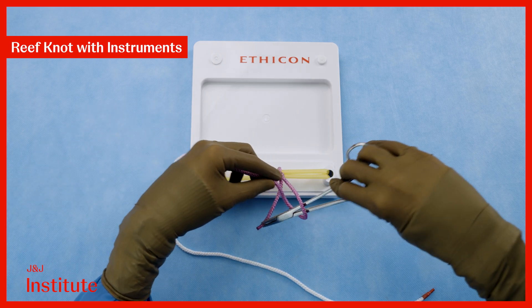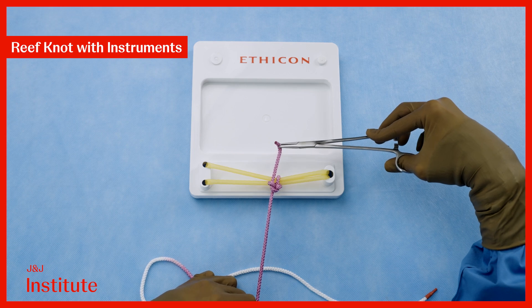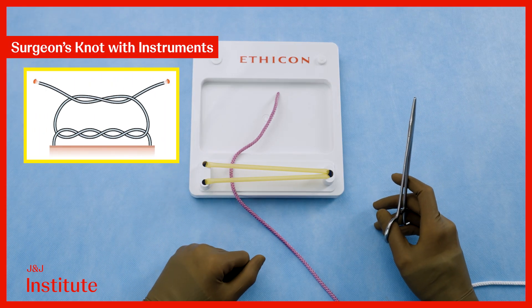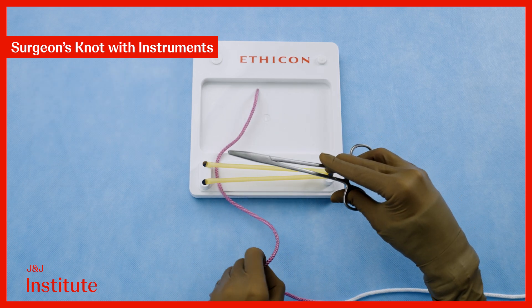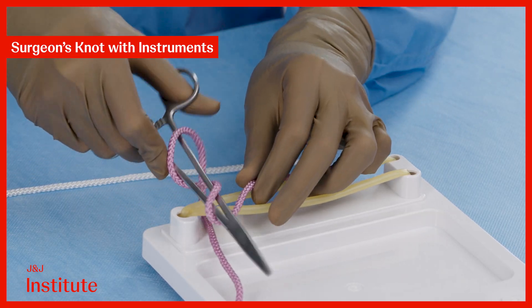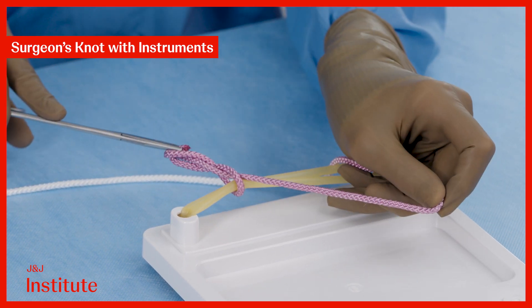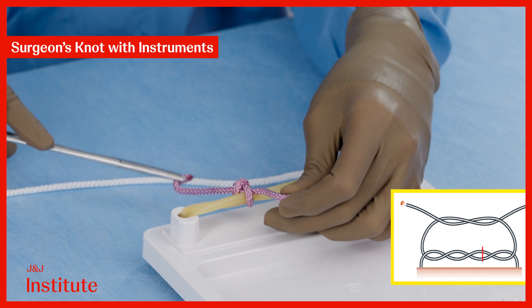Creating a surgeon's knot is easy with the needle driver. We start with the needle driver parallel to the incision and create a double loop on the long thread to begin. We then reach over and grab the short end, pulling it through the loop as we cross our hands.